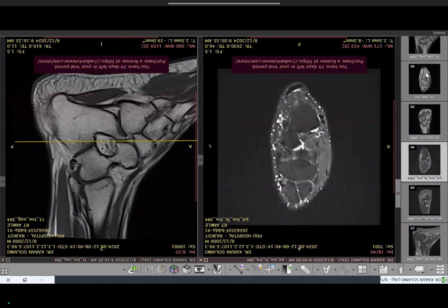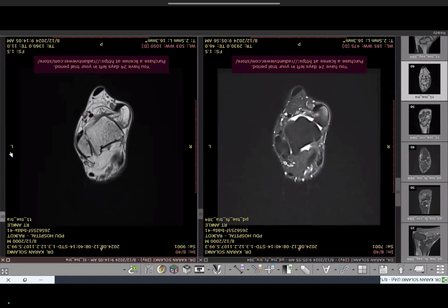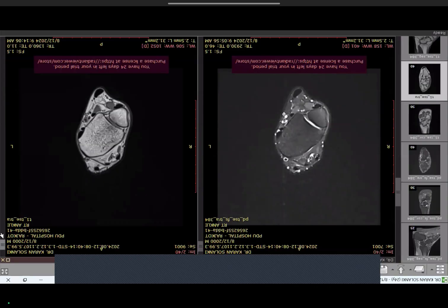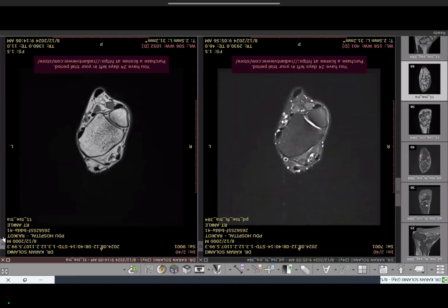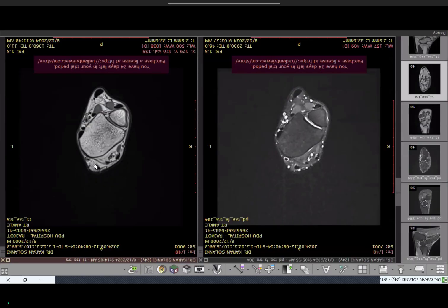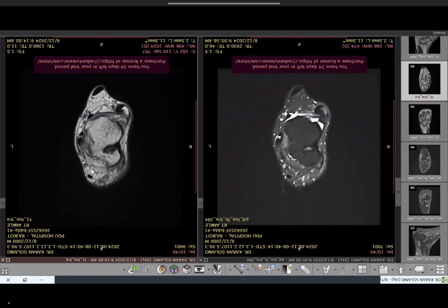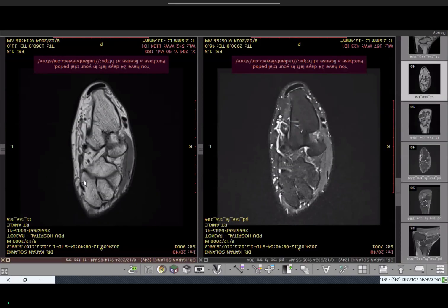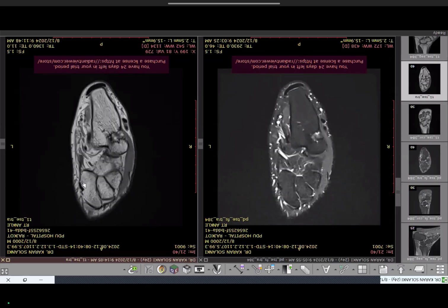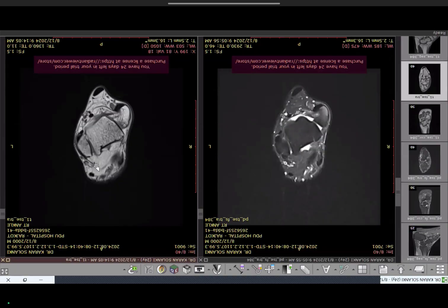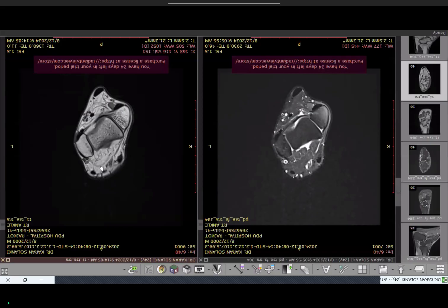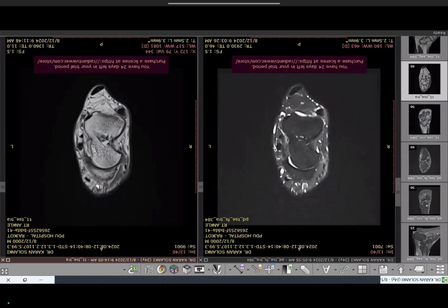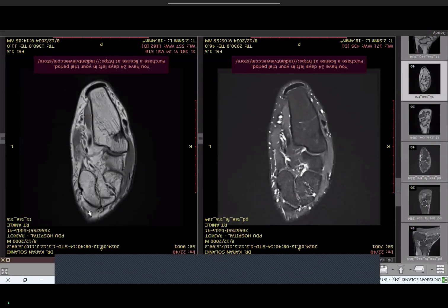In the axial sequence, starting at the superior most section, we look first at the tendinous anatomy. Along the extensor aspect we have the tibialis anterior tendon — trace it down to its insertion in the medial cuneiform bone. Any bump here is better visualized on coronal sequences; there is a higher chance of tendinosis and partial tear at the level of the insertion. The next tendon, about half the size, is extensor hallucis longus.